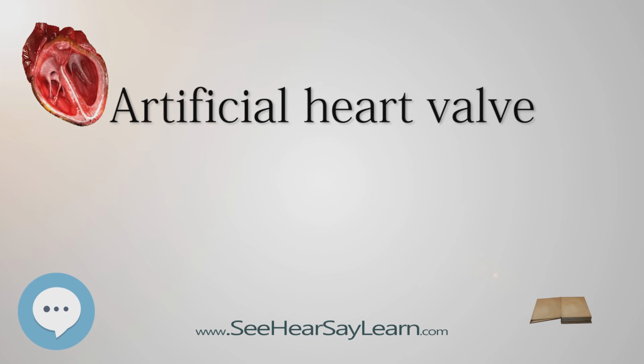These bileaflet valves have the advantage that they have a greater effective opening area, 2.4-3.2 square cm compared to 1.5-2.1 for the single leaflet valves. Also, they are the least thrombogenic of the artificial valves. Mechanical heart valves are today very reliable and allow the patient to live a normal life. Most mechanical valves last for at least 20 to 30 years.